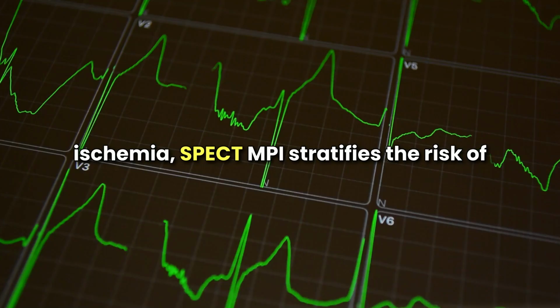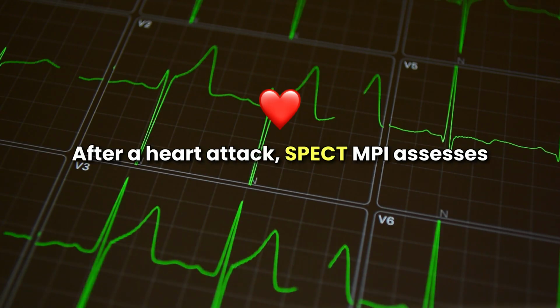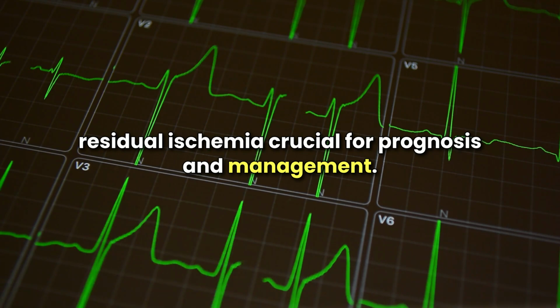By evaluating the severity and extent of ischemia, SPECT MPI stratifies the risk of future cardiac events, such as heart attacks. After a heart attack, SPECT MPI assesses the extent of myocardial damage and identifies residual ischemia, crucial for prognosis and management.